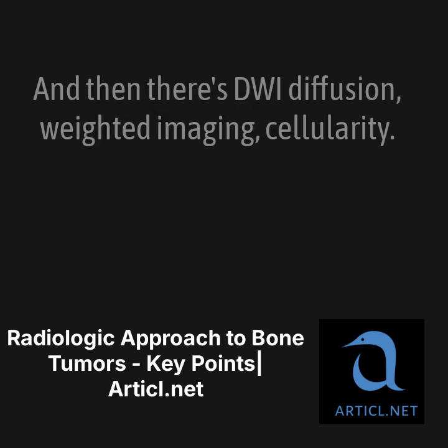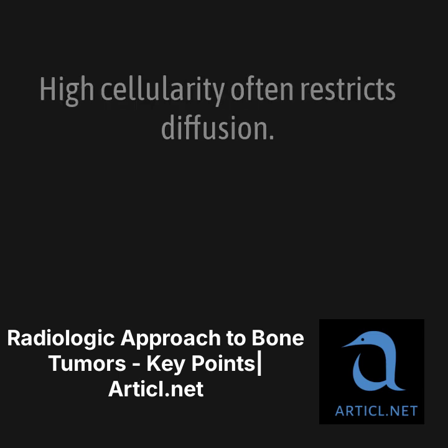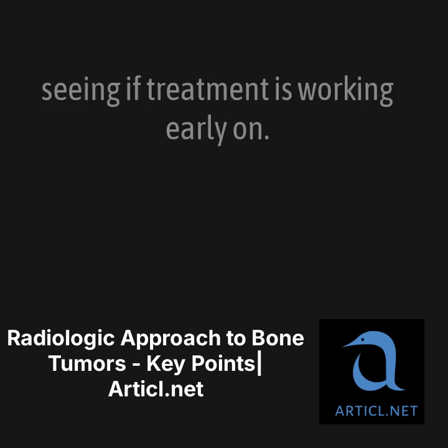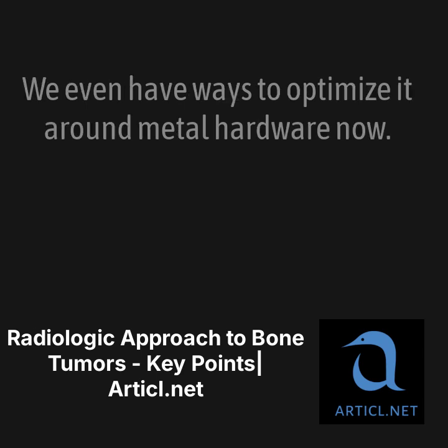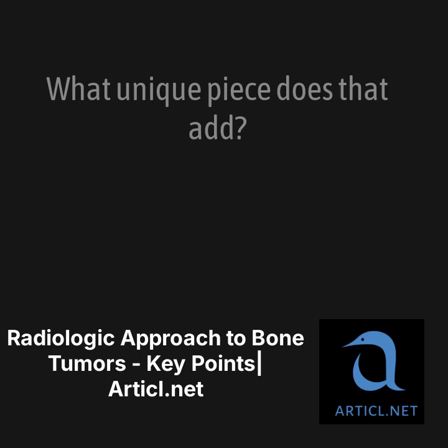And then there's DWI, diffusion-weighted imaging. Cellularity. And maybe treatment response. Exactly. High cellularity often restricts diffusion. It's also being used more for whole-body screening and seeing if treatment is working early on. We even have ways to optimize it around metal hardware now. Fascinating stuff. Okay, last modality, PET/CT. What unique piece does that add?